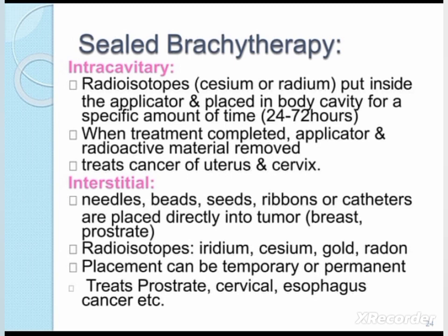When treatment is completed, the applicator and radioactive material will be removed. Especially for reproductive cancers such as uterine and cervical cancer, we are using intracavity radiation therapy.